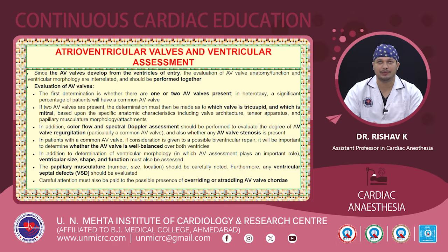However, in patients with atrioventricular discordance, it will be configured in such a way that the left atrium will be draining into the right ventricle through a morphologic tricuspid valve, while the right atrium will be leading into the left ventricle through a morphologic mitral valve. So the first determination to be made is whether there are one or two AV valves present, especially in patients with atrioventricular canal defects.